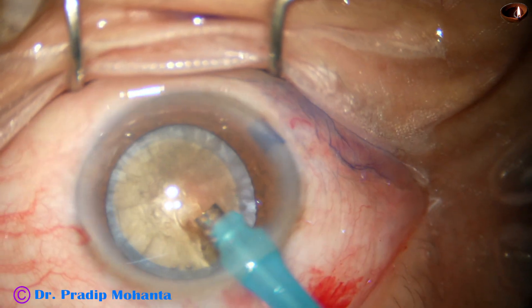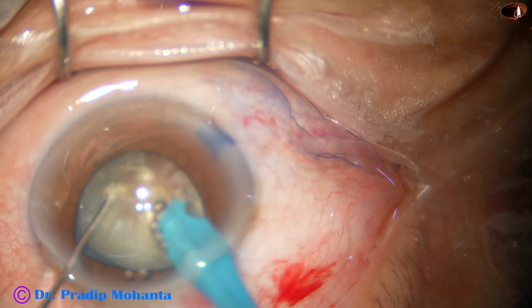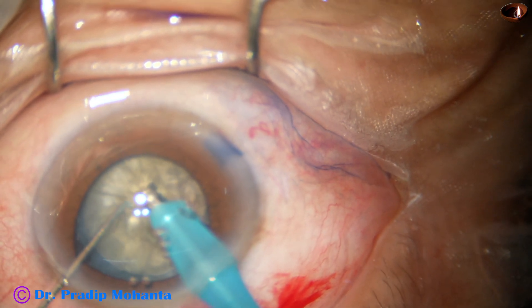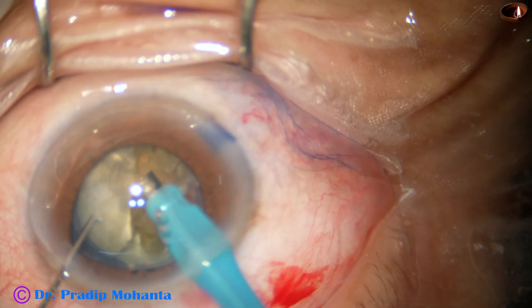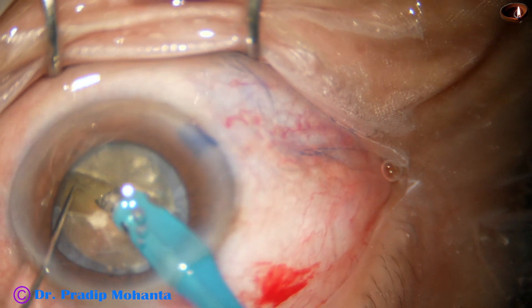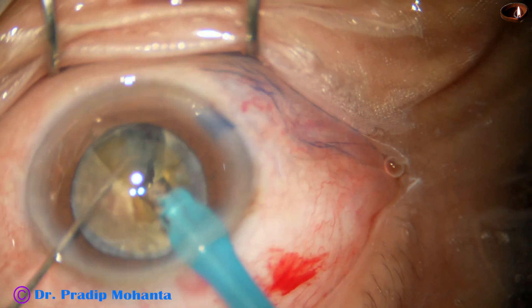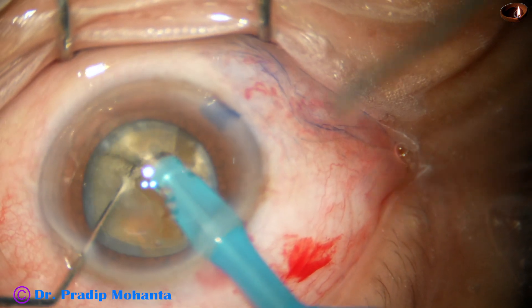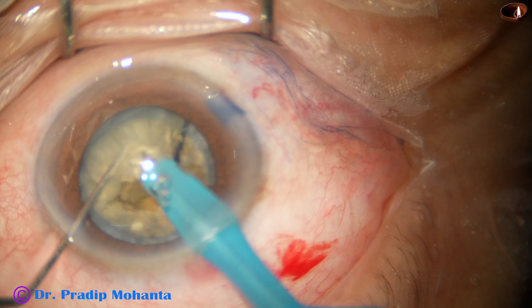My plan is to go through this tunnel and go like a submarine through the lens mass towards the opposite equator. I stop at the end of the hard part of the nucleus and now I use the chopper to get a nice crack. I rotate 180 degrees, sculpt and go deep, and then hold on hemi-nucleus and separate the two hemi-nuclei completely. Now this hemi-nucleus is larger; I am planning to divide it into three pieces. This is one piece, and now this big piece is again divided into two more small pieces.